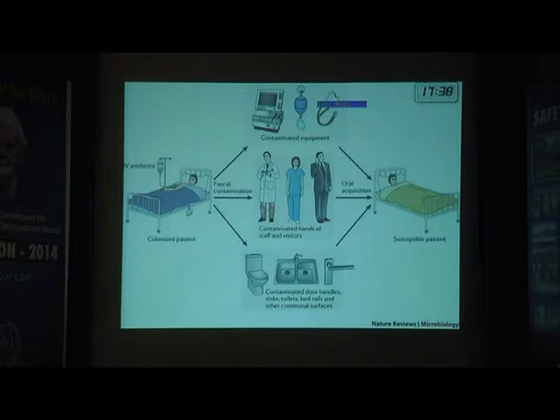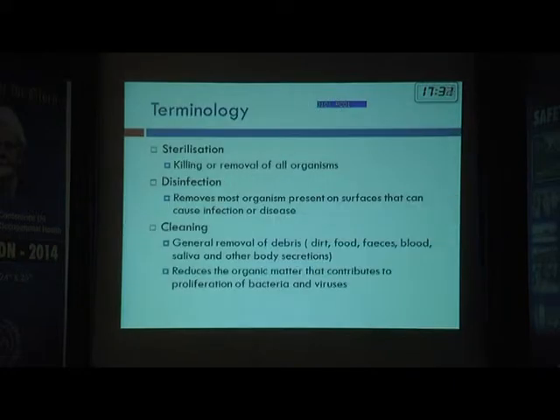So how do you control this? How are you able to keep him safe from all this? So these are the methods that we use. That is, we do methods of sterilization and disinfection of the instruments that we use, and of the environment that he's staying in, to make sure that we give him, or her, a safe environment.